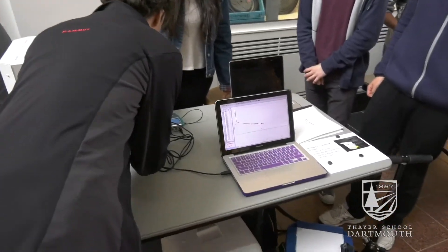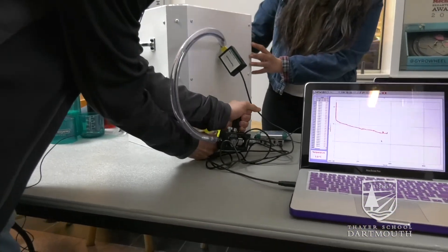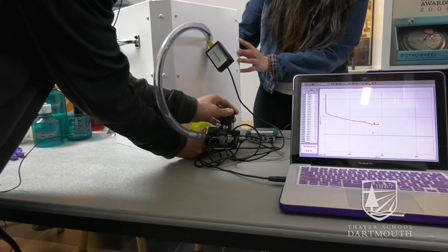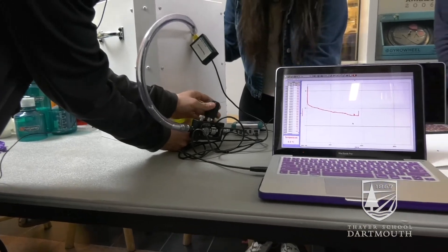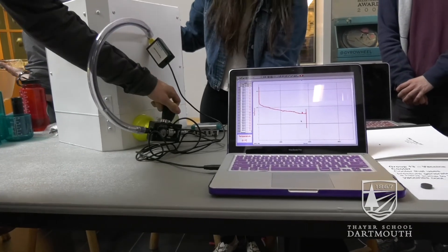I open up this valve. And when the gas starts to be released, the temperature — whoa, see that? See how the temperature just took a nose dive? It's gone below zero.